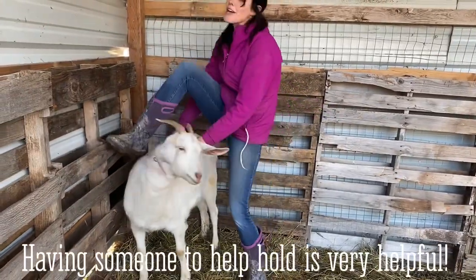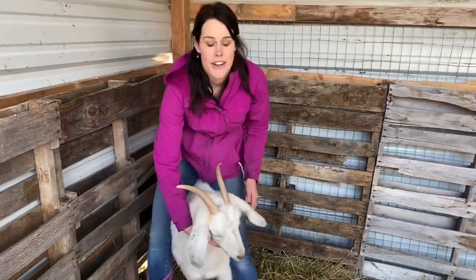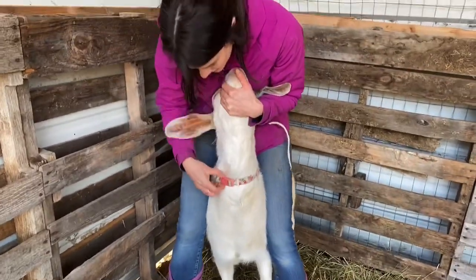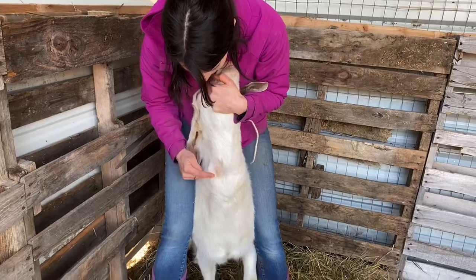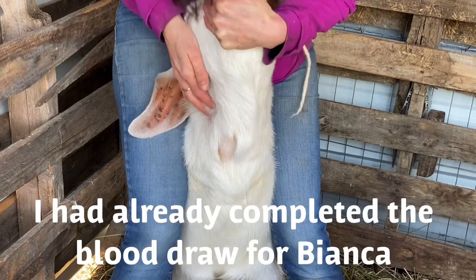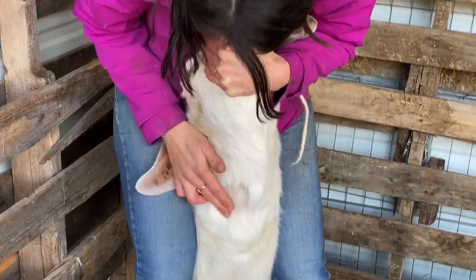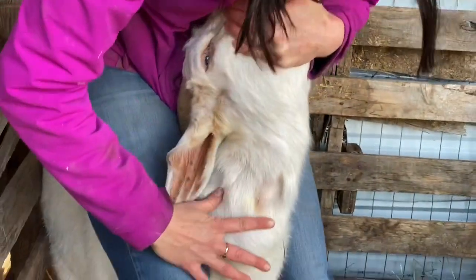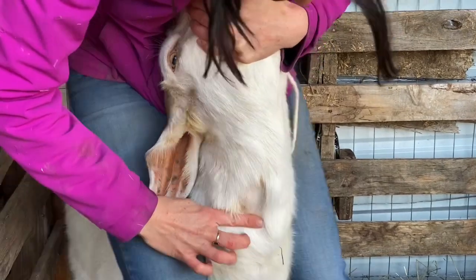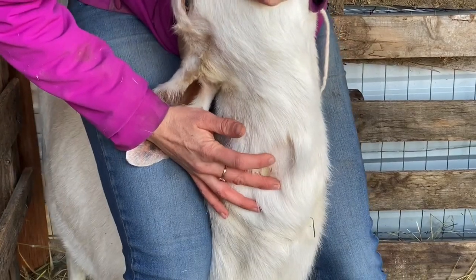This is how you hold it so that you can get to the right area. I'm just going to lift her head like this, kind of tuck it in, then take off her collar. Right here is the trachea in the middle, and then you can feel the hard muscle on either side — it's right in between. I shaved a little patch so I can see what I'm doing. If you just push right here, you can sort of see as that vein fills up it gets almost bouncy.